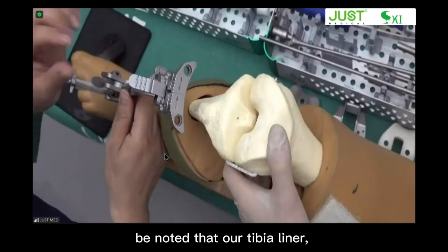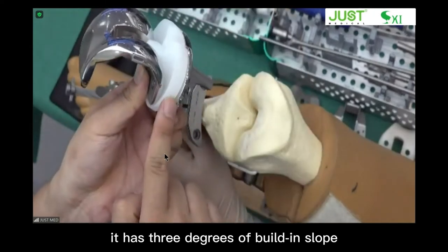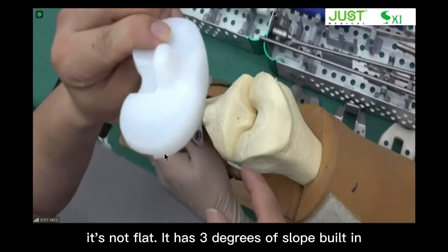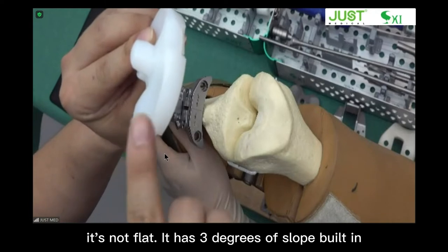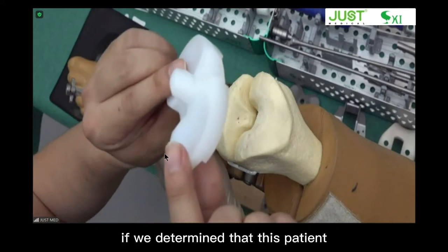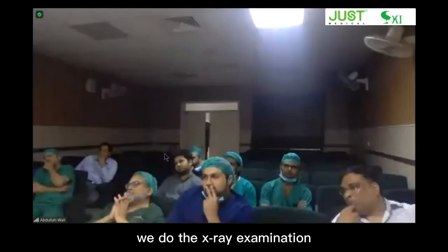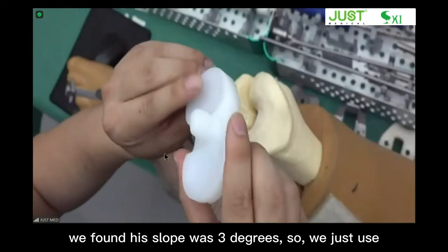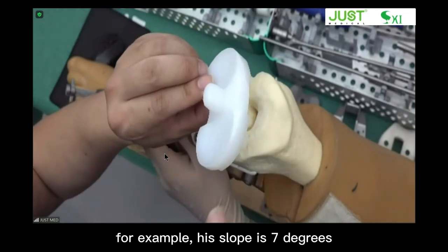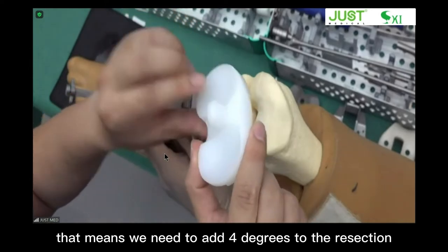You noted that our tibial liner has 3 degrees of built-in slope. It means it's not flat. It has 3 degrees of slope built into the design. So for example, if we determined that this patient's slope was 3 degrees before the surgery, we do the x-ray examination and we found his slope was 3 degrees, so we just use our tibial bearing. But if you find, for example, his slope is 7 degrees, that means we need to add 4 degrees to the resection.